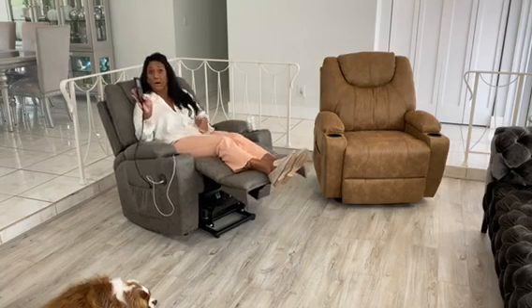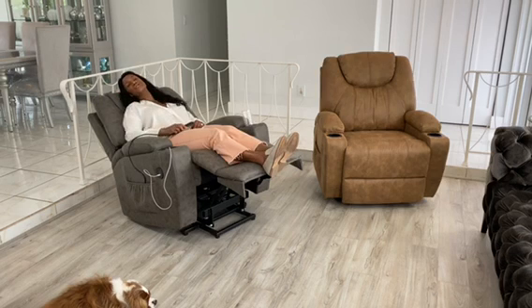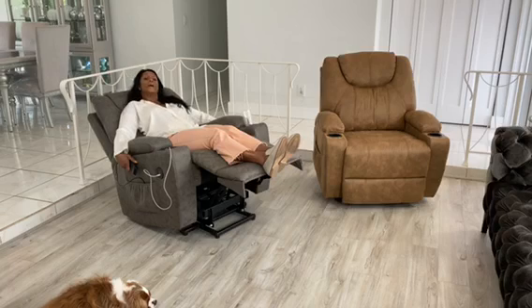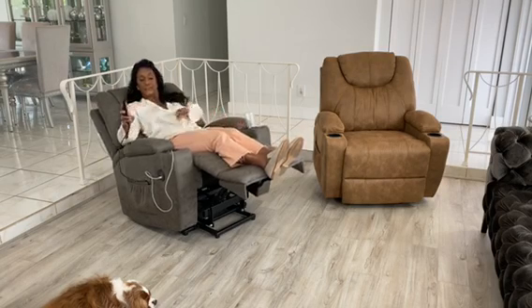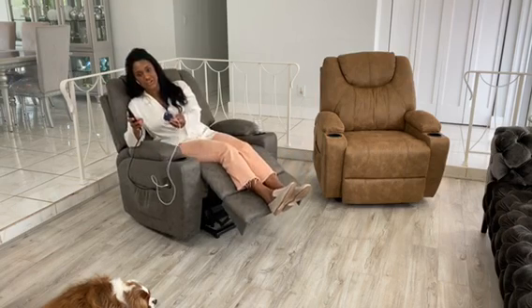And then I can even, again with just the touch of a button, fully recline and sleep in this chair if I wanted to. I love the two side pockets to hold my remote control or my readers. And I also love that it has two cup holders.